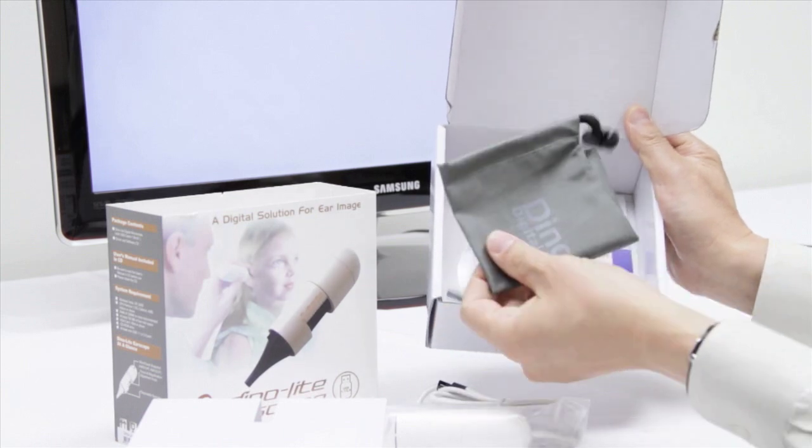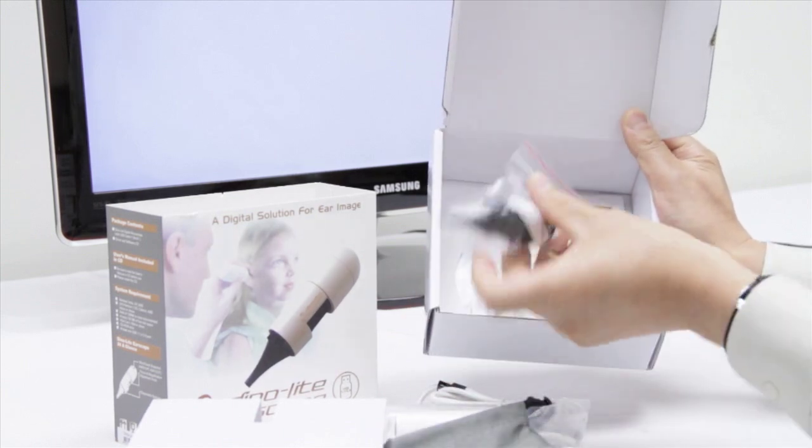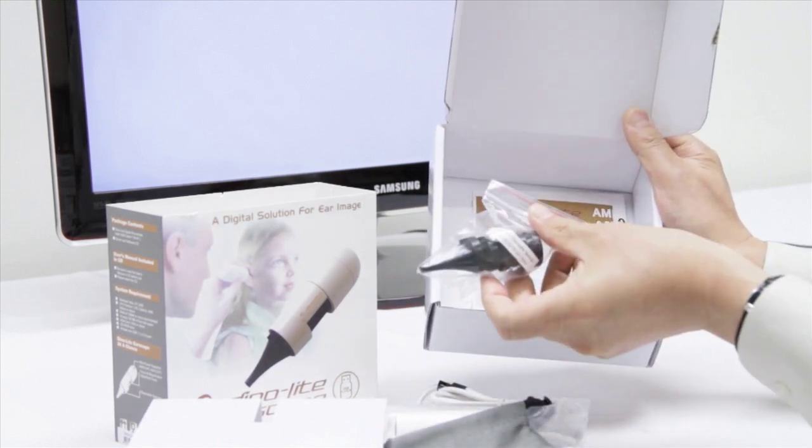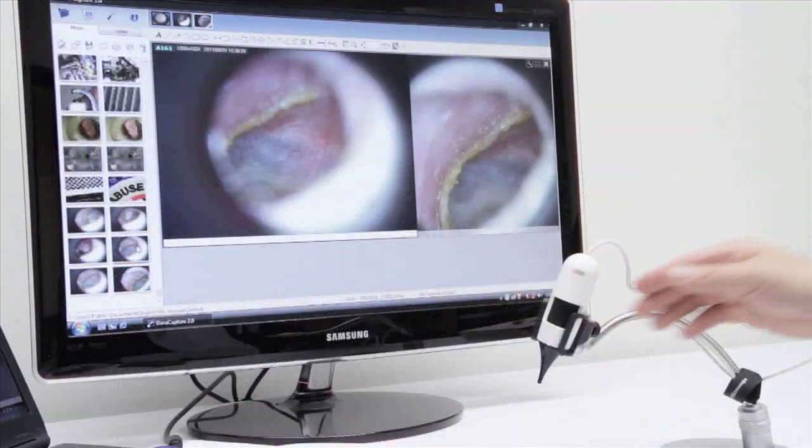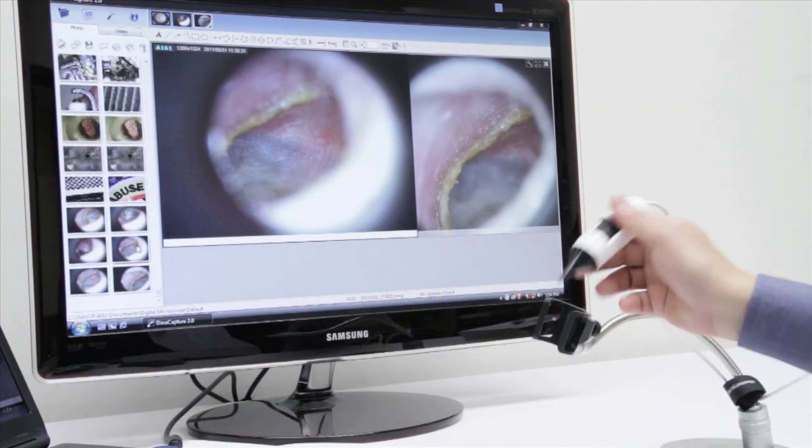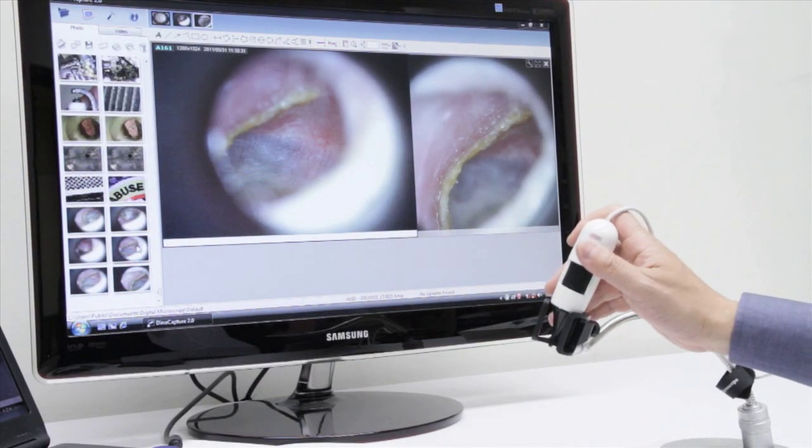Within the box you will also find an instruction guide as well as a software downloadable CD. This scope works with any stand that we offer.